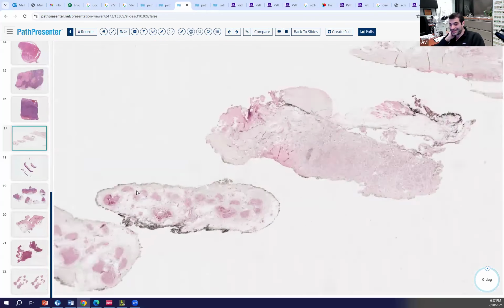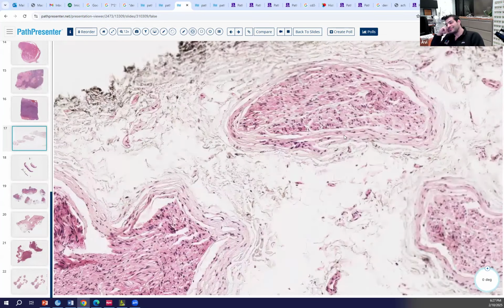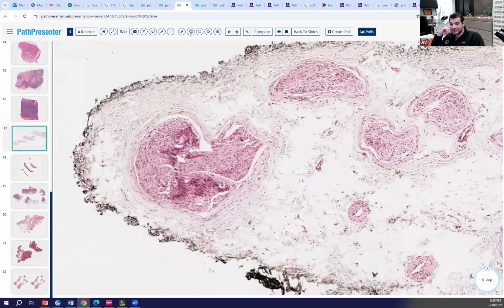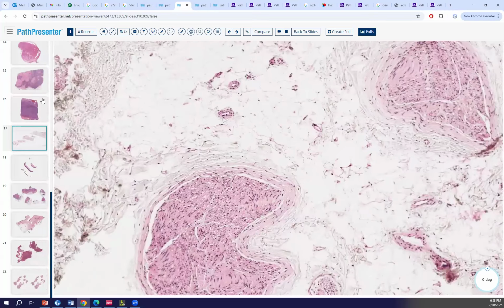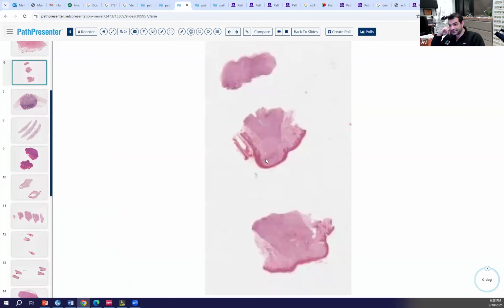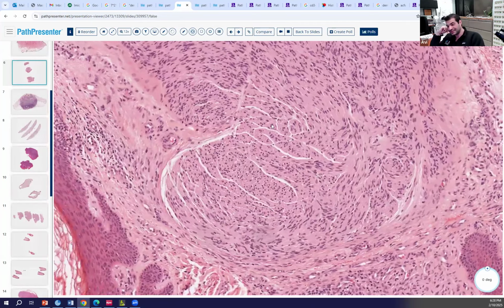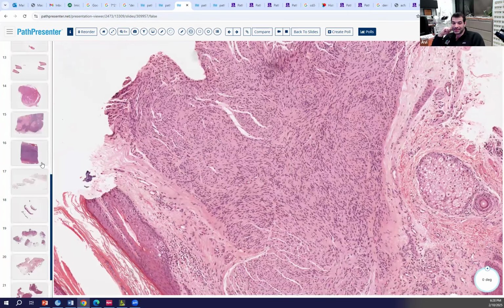Now this is legit nerve bundles that are haphazardly organized. So if someone, is this palisaded encapsulated neuroma? No. Palisaded encapsulated neuroma, well, that's very interesting. What do you think this thing is? This is the palisaded, yeah. This is the palisaded encapsulated neuroma, superficial spindle cell clefting. See the clefts? Someone took a sledgehammer and smashed it. This is the palisaded encapsulated neuroma.